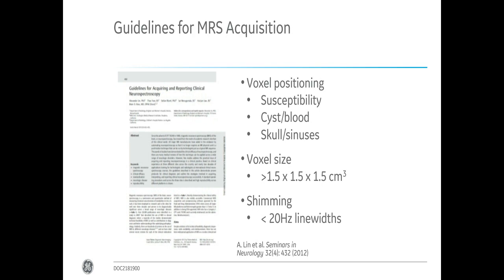So really concentrating again on the voxel positioning, the problems you can run into, that voxel size matters, so not going below this most of the time, and shimming.